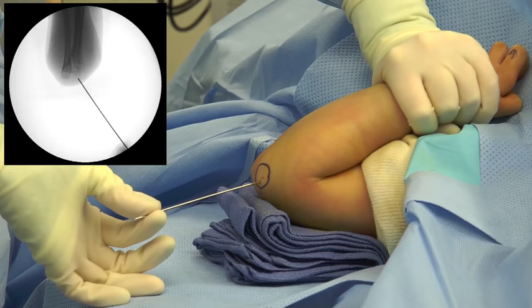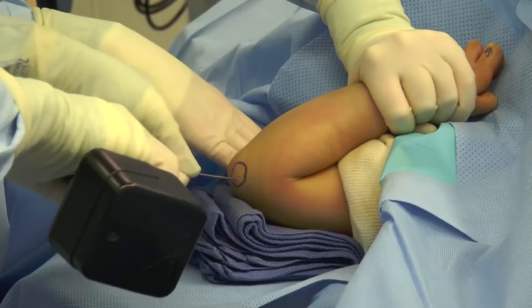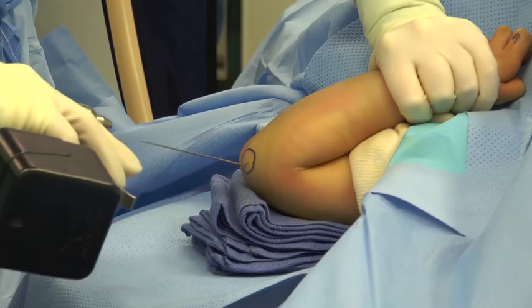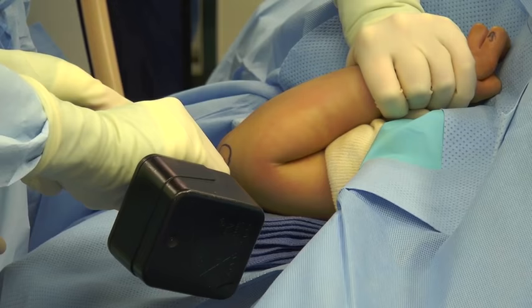The assistant will hold the K-wire and then the surgeon will bring in the wire driver. The humerus is usually on an incline due to the towels underneath the humerus, and this needs to be considered when placing the pin trajectory. The pins are passed until such time as they have bicortical purchase. Sometimes they will pass across the olecranon fossa and encounter four cortices.